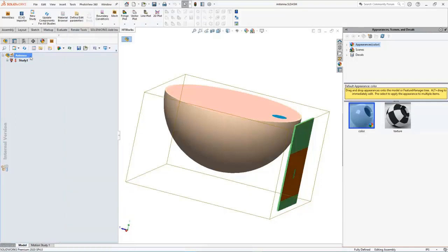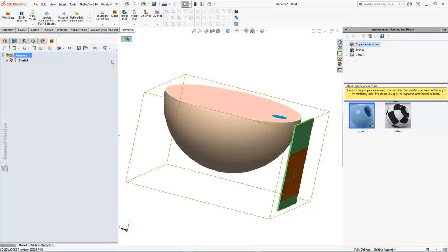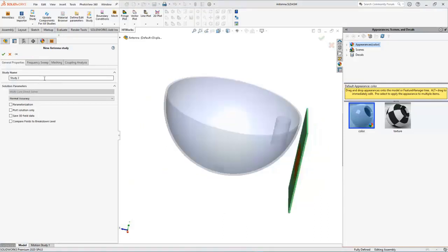In HFWorks, every simulation is a study. Under the name of our assembly, there are different configurations. So we have here antennas, S-parameter, time domain reflectometry, and resonance. If you want to study this antenna, for example, just create an antenna study. In this case, we are interested in an antenna simulation. You can name the study after selecting the study type. Choose the accuracy, normal or high accuracy.